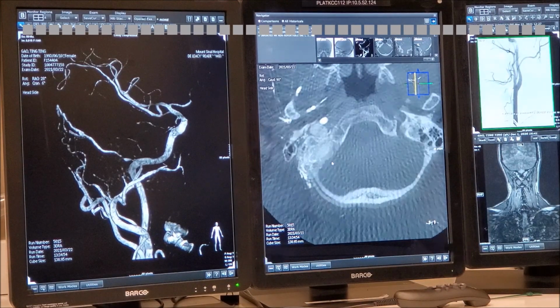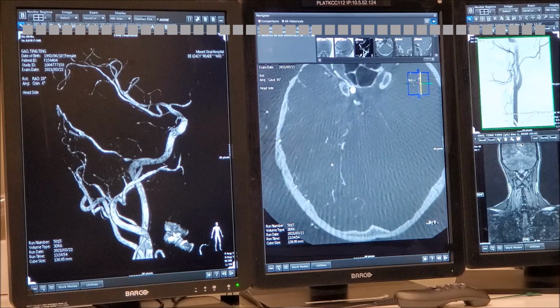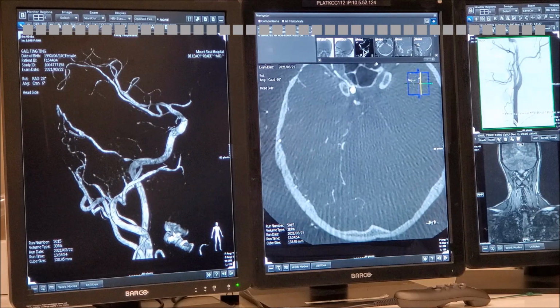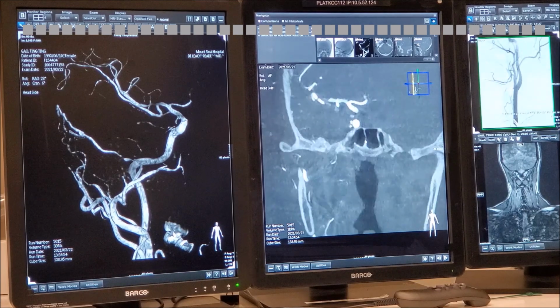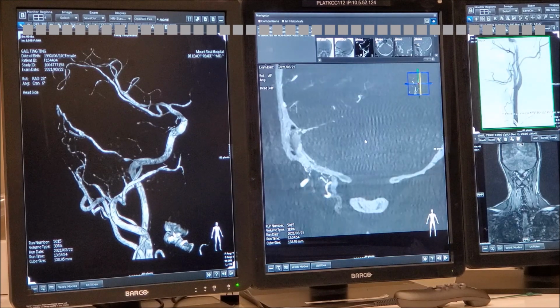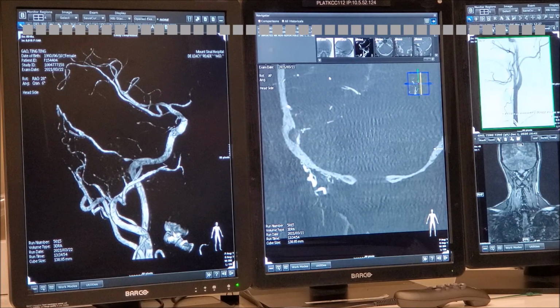Okay. Okay, this is good. Here's the one that we had from the basal tentorium from the internal carotid artery. You need to put more contrast to get really nice pictures like this. But you see here on the wall. Do you see that 360 turn of occipital? There was a turn of occipital that you thought was going through the mastoid bone.